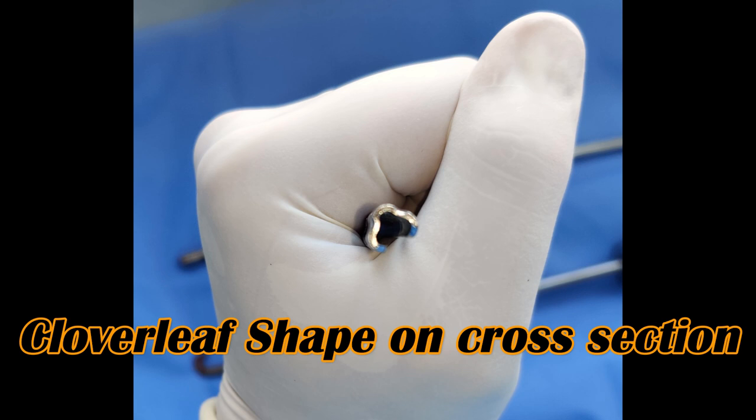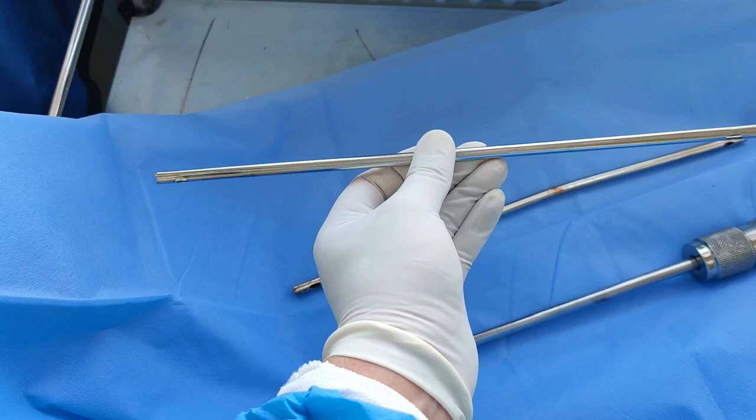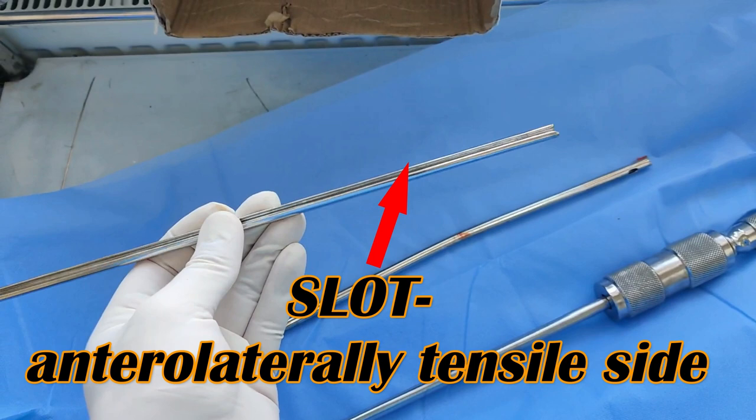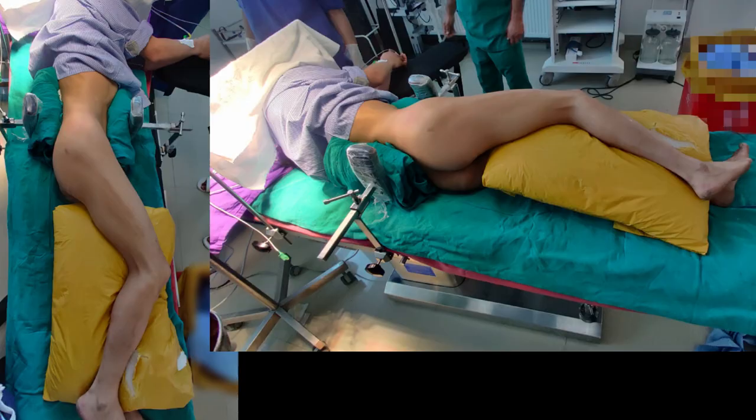The design of the femoral K nail is such that on a cross-section view it is a cloverleaf-shaped nail with a hollow core, so that one can admit a guide wire in it. It has a slot, as you can see here, and this is placed anterolaterally on the tensile side. It has an eye on both sides that is used for extraction of the femoral nail.